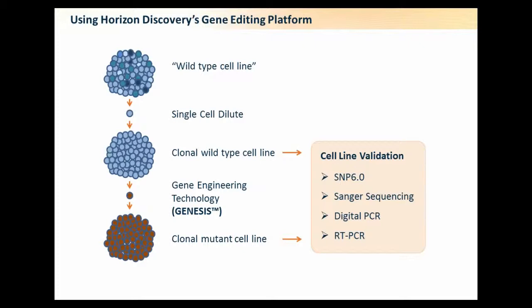So let's get back into the second half, and this is for me the more interesting part because it's actually got some more nitty-gritty of the data. So it's important for me to introduce how we make reference standards to then tell you how we can test the NGS platforms.